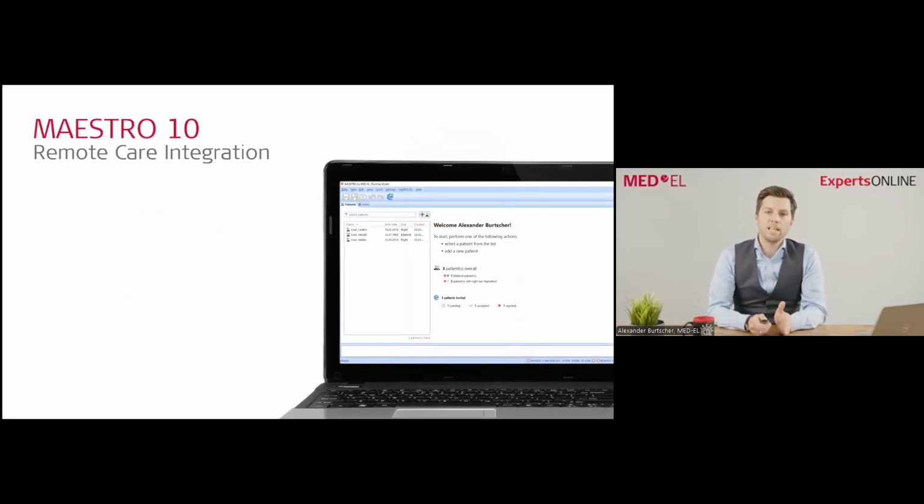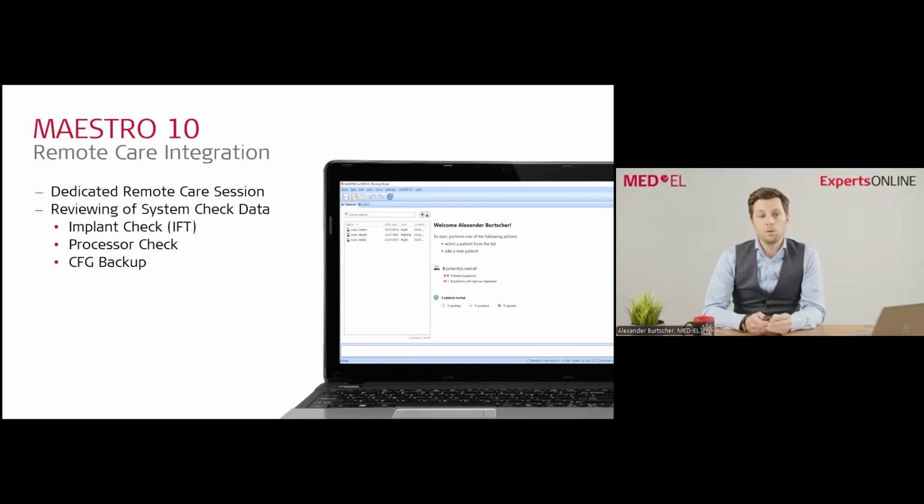And just to show you how remote care is integrated into the new Maestro 10 software, Maestro 10 has now a dedicated remote care session. So you know there's an intra-op session, there's a post-op session, and now there's also a remote care session. In this remote care session, the clinician can review those system check data that we just mentioned. So they would see the results of the implant check, they would see the results of the processor check, and they also get this audio processor backup delivered into Maestro if available. The implant check is shown in the exactly same screen that you would review your telemetries that you do in clinic. Also, the display is very much the same.